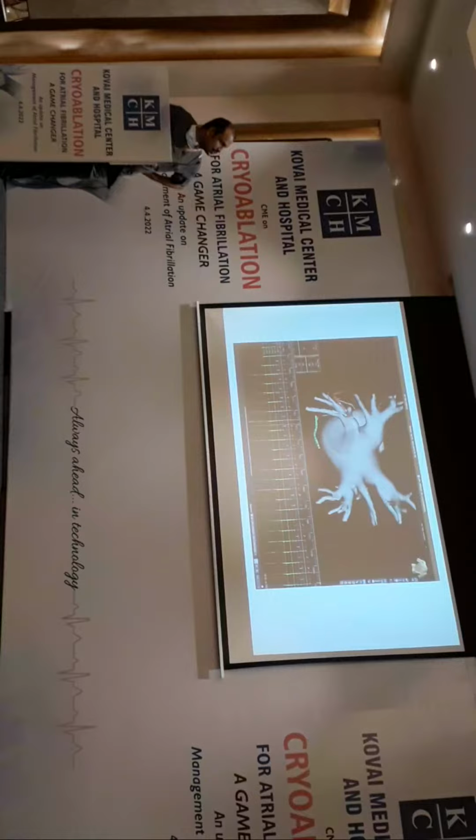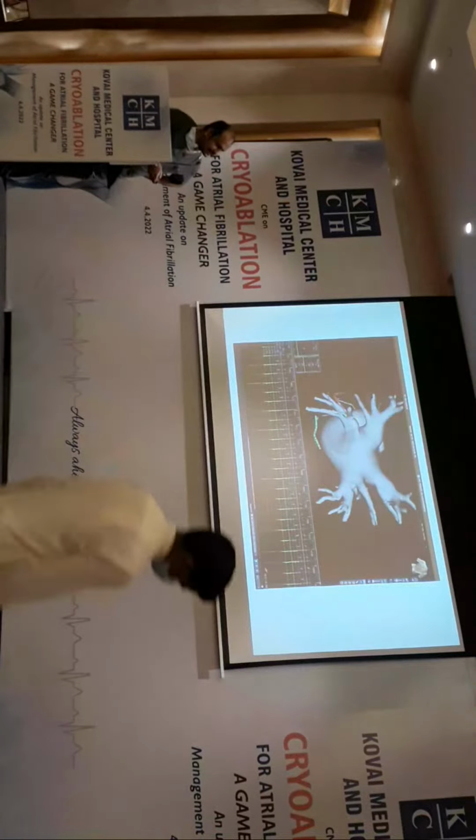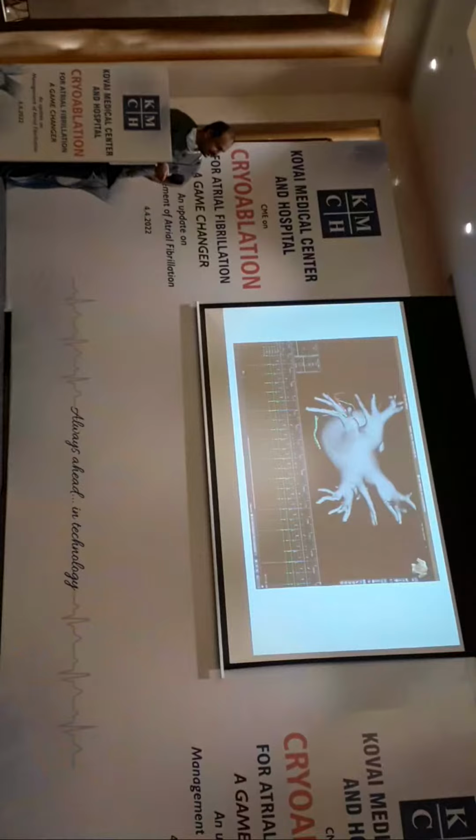So this is a short video of what we are doing. You can see the catheter here. We have started the freeze, and slowly you can see the pulmonary vein potentials are lost. You can clearly see here there are pulmonary vein potentials. Once we started the freeze, the pulmonary vein potentials have completely disappeared.